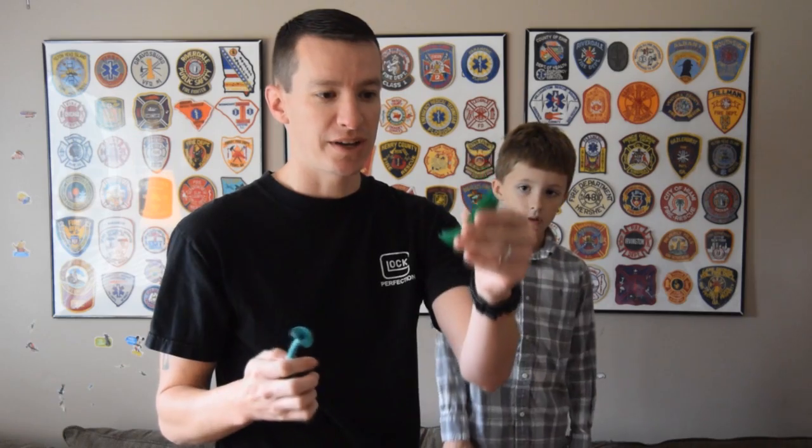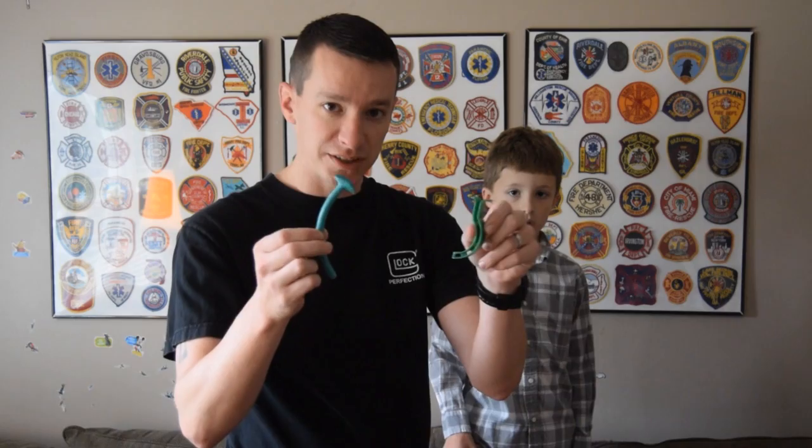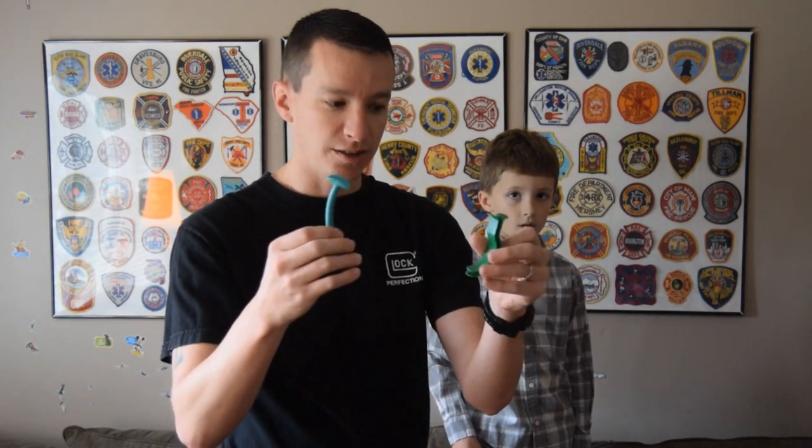Welcome to another video from Skinnymedic. I want to talk about in this video when the appropriate time is to insert each of these airway adjuncts. I've done separate videos on inserting OPA as well as another video on inserting NPA, and I talk about how to measure and insert both these devices individually.